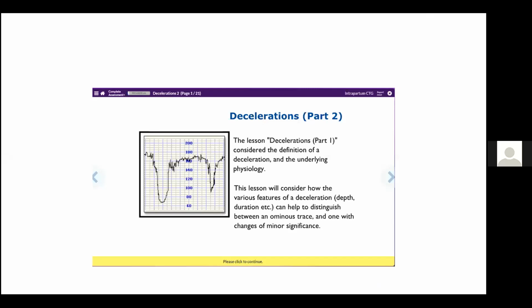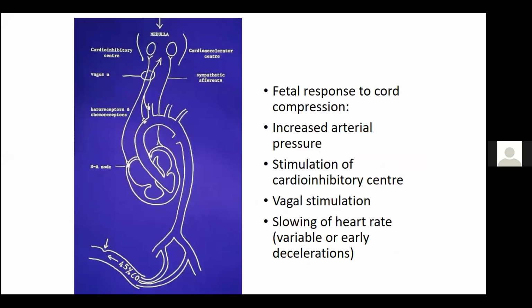I'm going to move on, colleagues, to talk about decelerations. And decelerations, a lot of us talk about early and late decelerations. And decelerations is actually the response, right, of the vagal nerve, right?